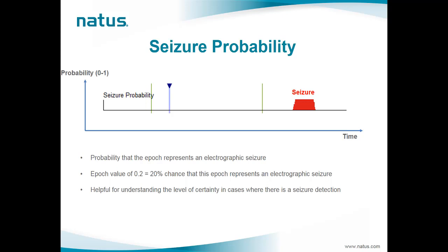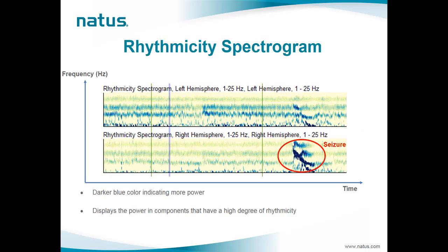Since the seizure detection probability function is validated at discrete values of 0.0, 0.2, 0.4, and so on up to 1.0, only those discrete values are presented. The rhythmicity spectrogram trend is often displayed separately for the left and right hemispheres, but may be modified to display individual channels or groups of channels. It is very similar to the color density spectral array or FFT spectrogram trend, with time on the x-axis and frequency on the y-axis, and power displayed by color coding — darker blue indicating more power.